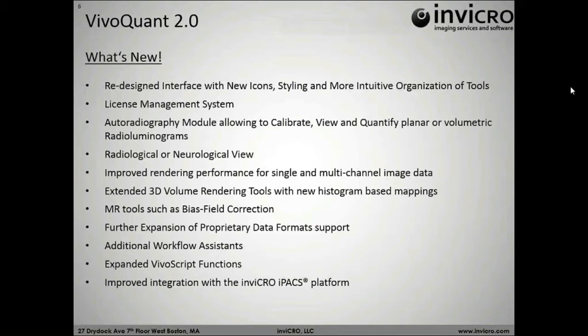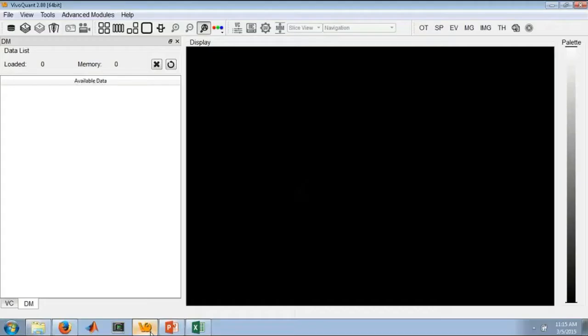If I do miss something that you really want us to go back and review, or if you have additional questions after the call, feel free to reach out to your inviCRO account manager or support at invicro.com. So here we have it, the new VivoQuant 2.0. The first thing you'll notice right off the bat, the buttons have all changed colors.